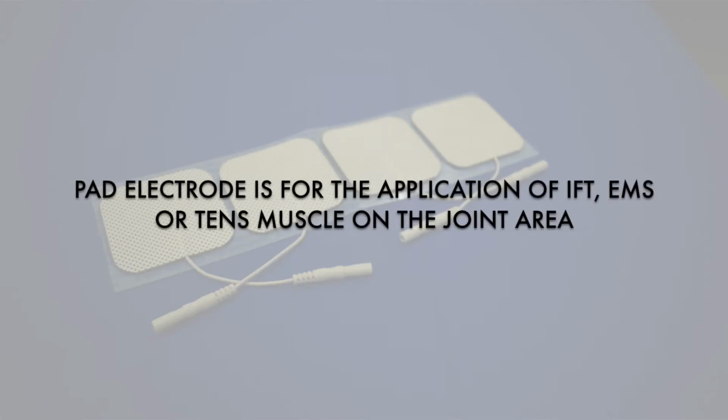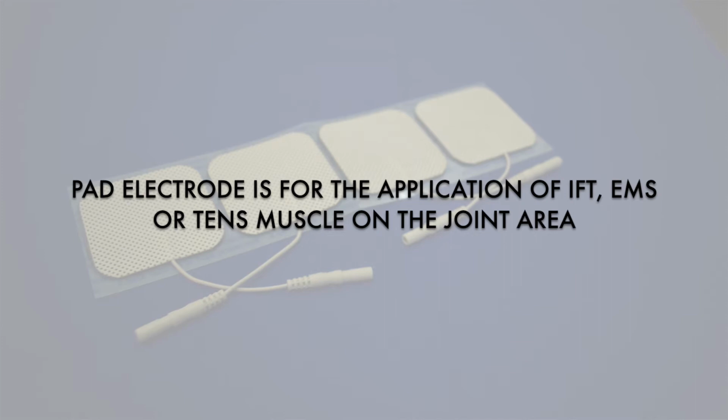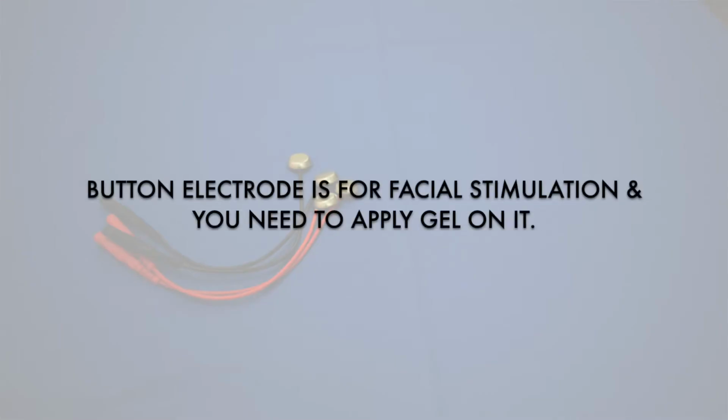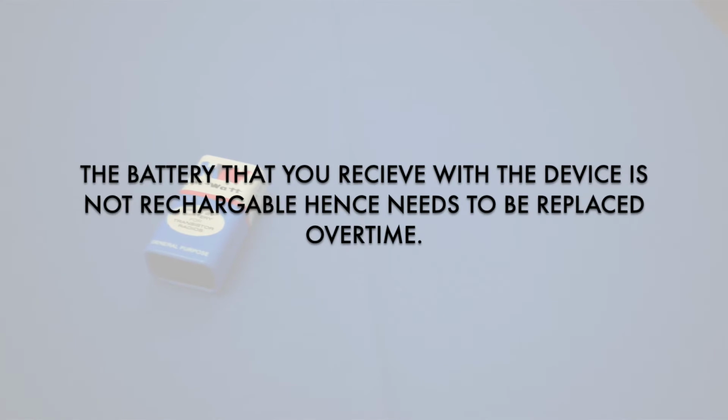Here are a few things that you should keep in mind while using this device. The pad electrode that you receive with this device is for application of IFT, TENS or EMS programs on muscles or joint areas. You need not apply any gel to these electrodes as they come in sticker form. The button electrode that you receive with the device is for facial stimulation. You need to apply gel to these electrodes and later place them on the facial muscles that need to be stimulated.